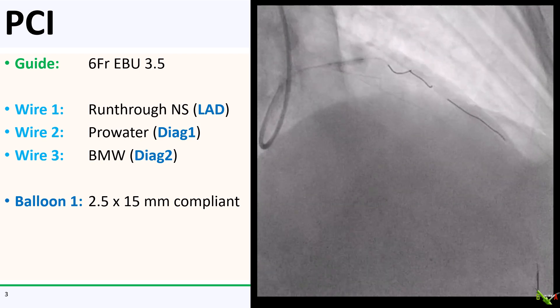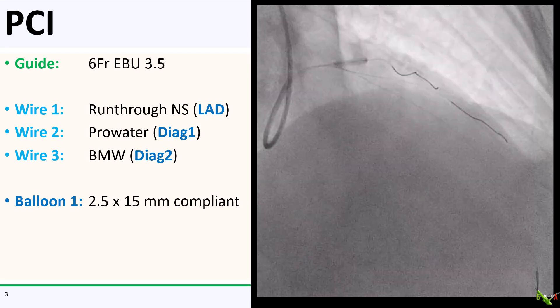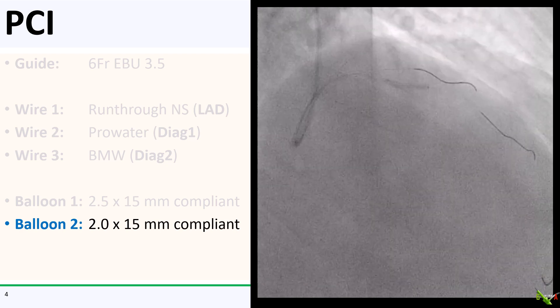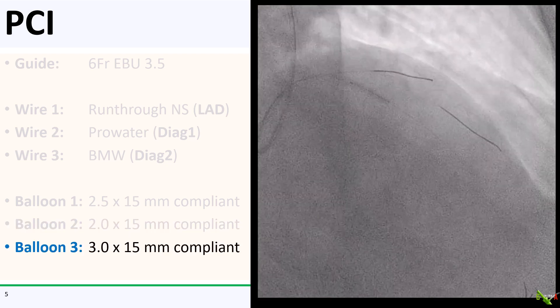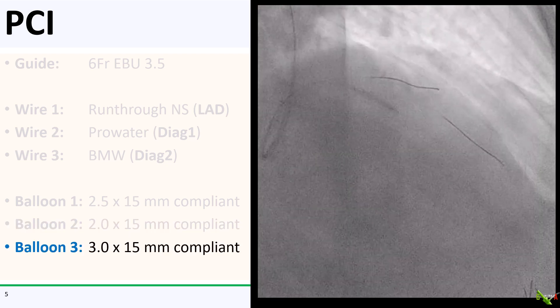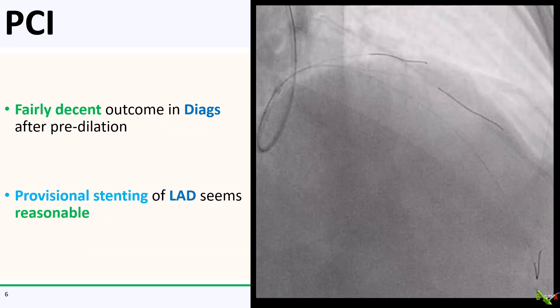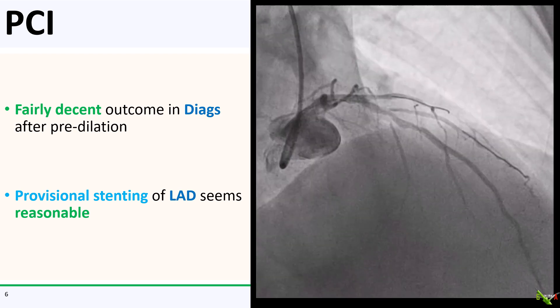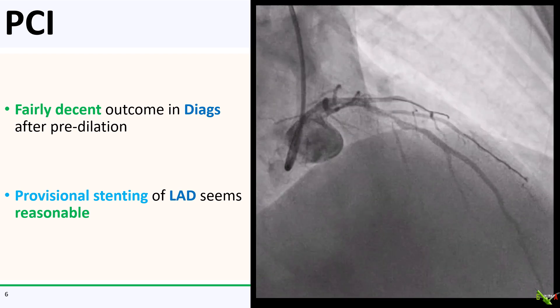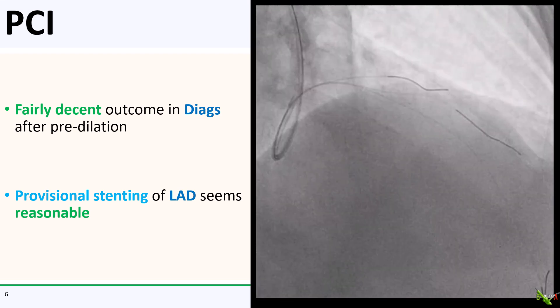Here you see dilation of the first diagonal with a 2.5 by 15 millimeter compliant balloon. The second diagonal was dilated with a 2.0 by 15 millimeter compliant balloon, and the LAD with a 3.0 compliant balloon. After balloon angioplasty, we had a fairly decent result in the diagonal branches, so I decided to keep things simple and just provisionally stent the LAD.